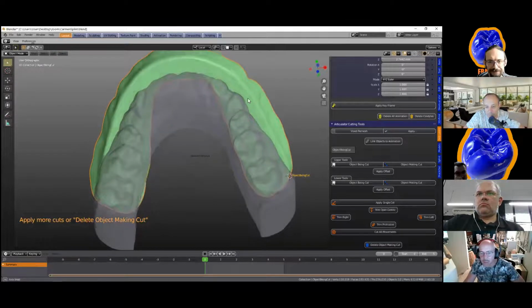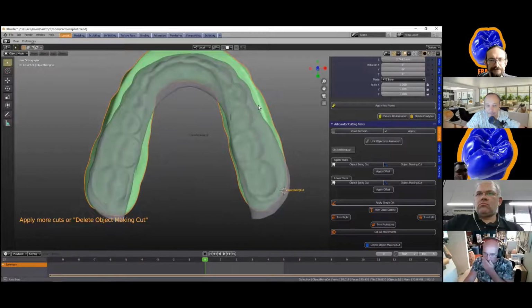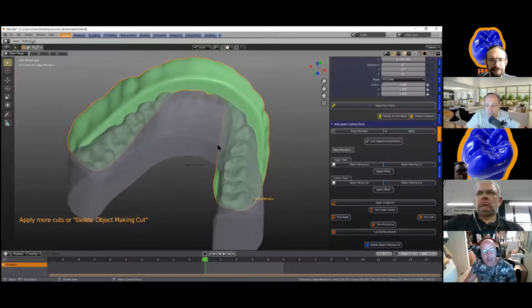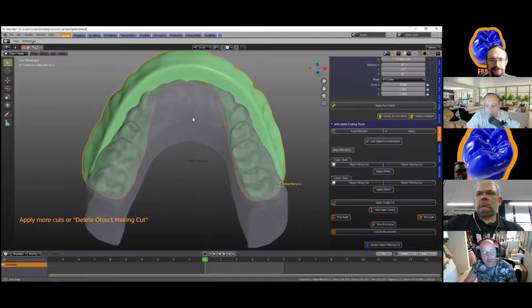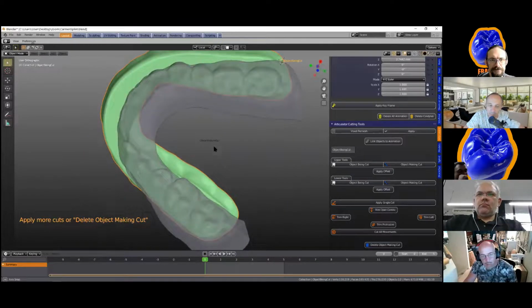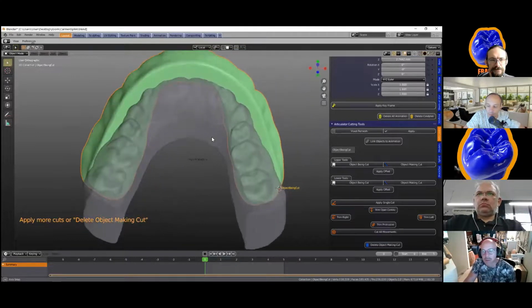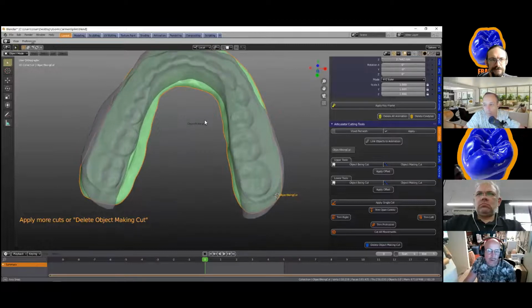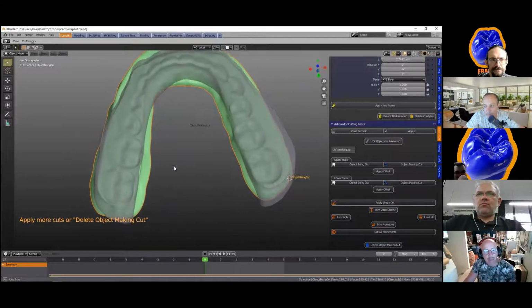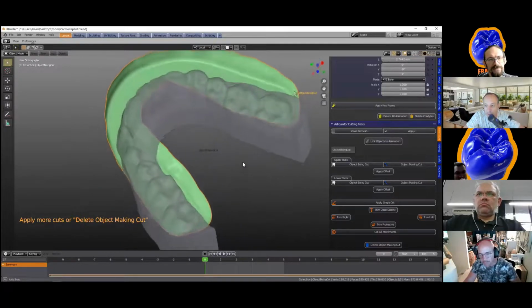All right, so here we've got a one-off cut, and we can see through this model. Again, for a mouth guard, those of you that have the correct printers with the mouth guard material, I wish we had one, Wolfgang, to make a few. Maybe some of our users have. We can test it or something. Although we have once before, haven't we? It was an FDM printer, I think. Yeah, FDM with a thermoplastic.